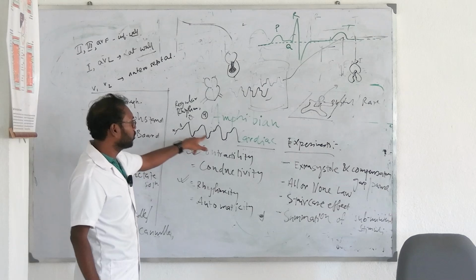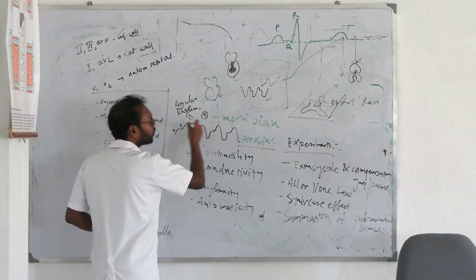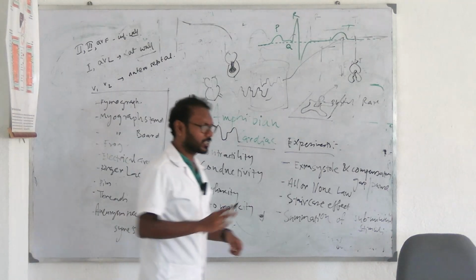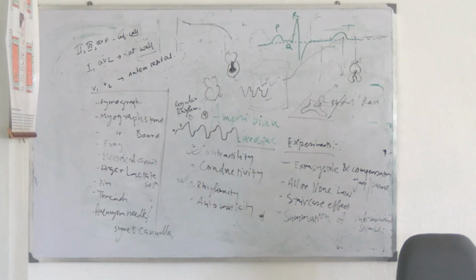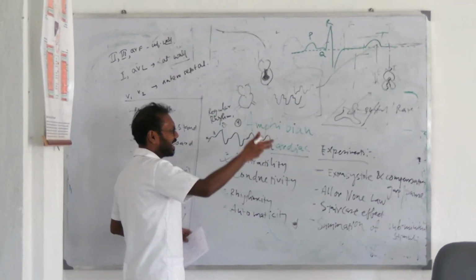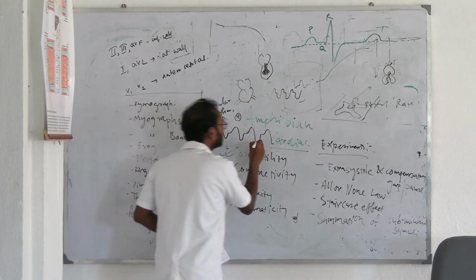Forming a regular interval, and also the peak, meaning the force of contraction, the intensity or the force of contraction is also, wait, did the paper fly away, it's here, and the intensity or the force of contraction is also similar, look. So that means it's rhythmic. Now automaticity. Do you see us putting other objectives in beside, in behind, or in between these areas?